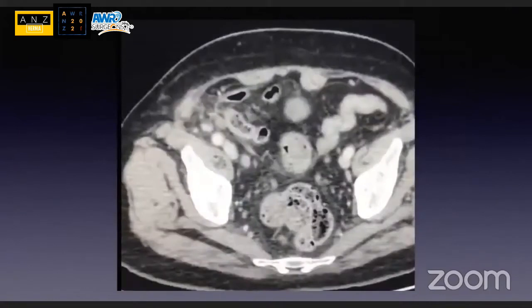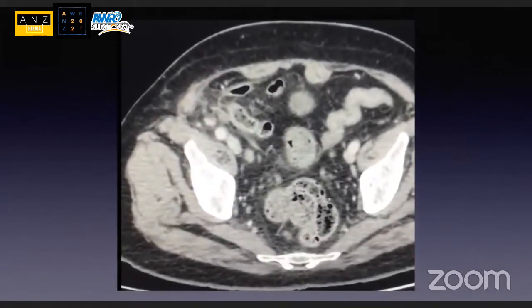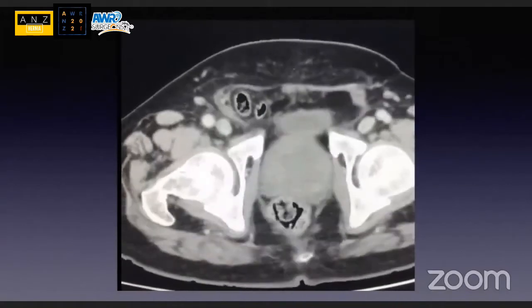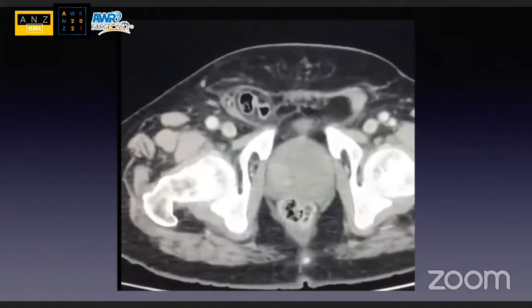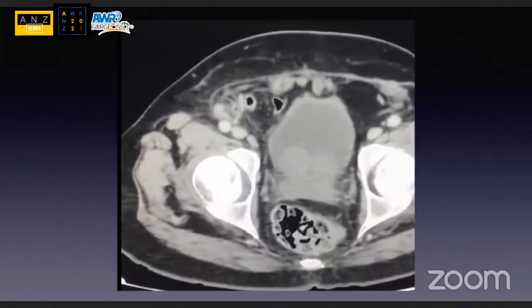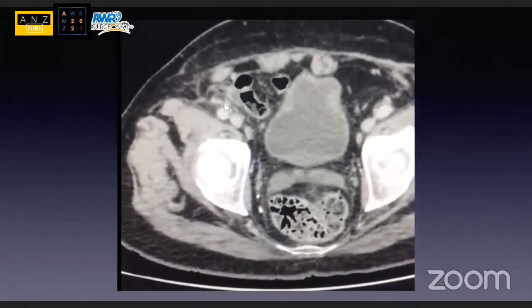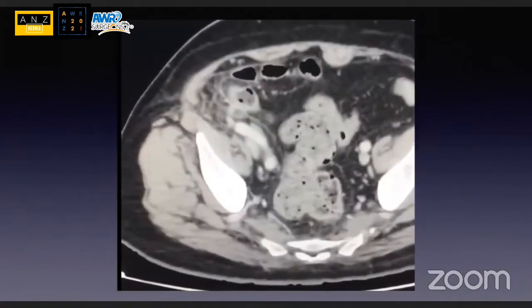And here is a little movie of a recent case of an 80-year-old gentleman with right-sided abdominal pain who has a hernia, and it was conceived by the younger surgeons that this could be the cause. Here we can see the hernia. One thing I would just like to point out to you is the epigastric vessel just coming here. This sac is medial to the epigastric vessels, and therefore it is a direct inguinal sac. And you also saw a little of the lateral crescent sign.